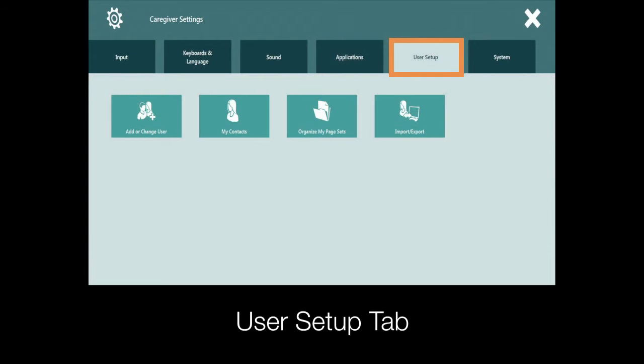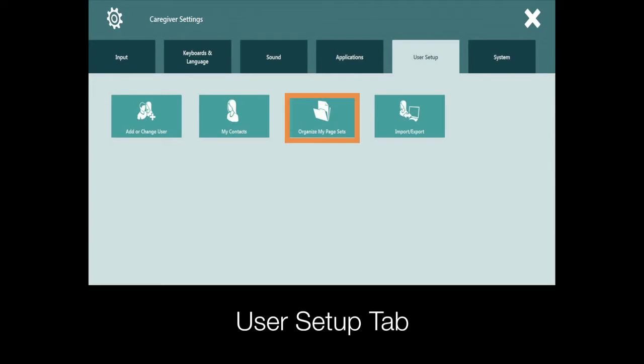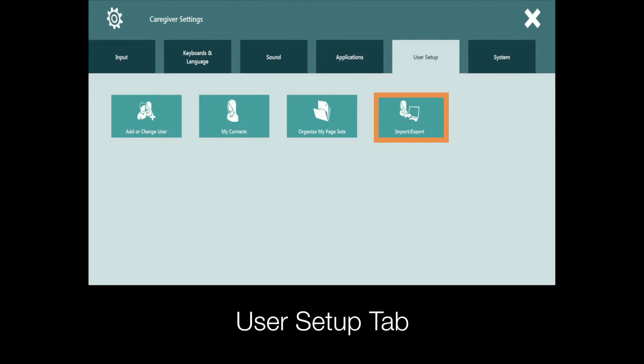Moving on to the User Setup tab, this is where you will manage all new and existing users and organize your custom-made page sets. The Import-Export button will allow you to move user settings and data from system to system. For example, if you've created a user on your computer and want to move it to your device.